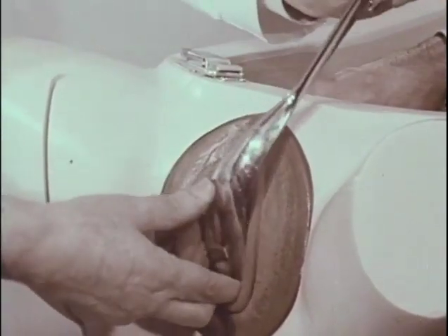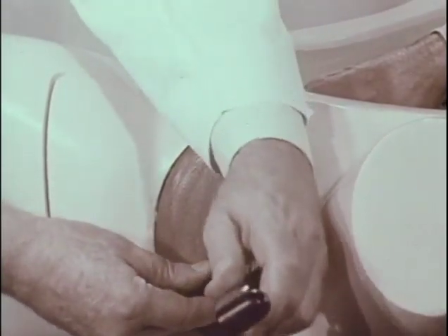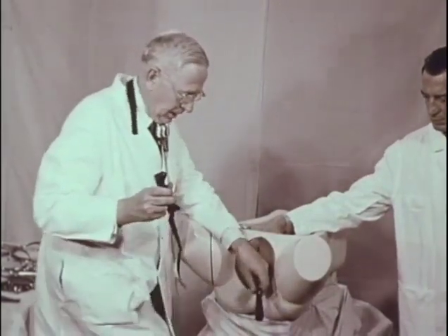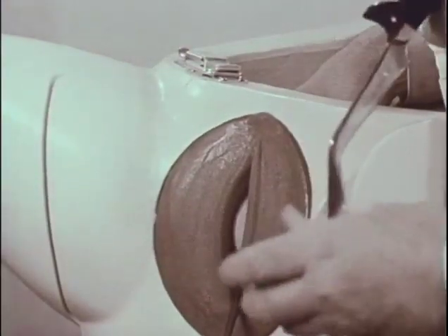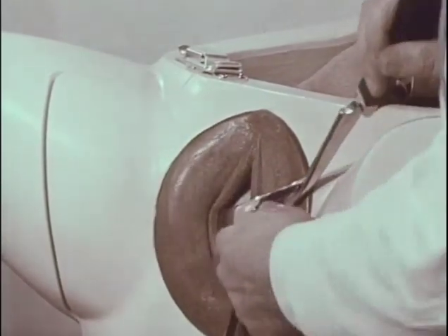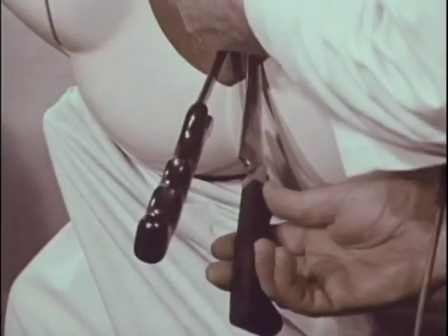So that the introduction is directly along the whole of the sacrum, behind the posterior parietal bone, and the handle is dropped in a straight line parallel to the perpendicular as the blade passes up in behind the posterior parietal bone. Then the right or anterior blade is inserted by the wandering maneuver. The handle of which is held in the right hand, is inserted to the right side, rather high up away from the perineum in order to avoid the posterior frontal eminence. And as the blade passes from view, the handle is dropped well down below that of the posterior blade.